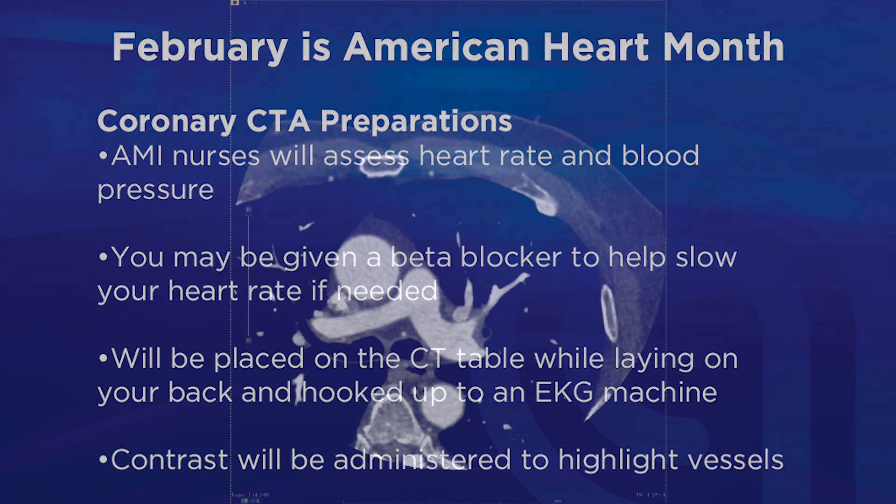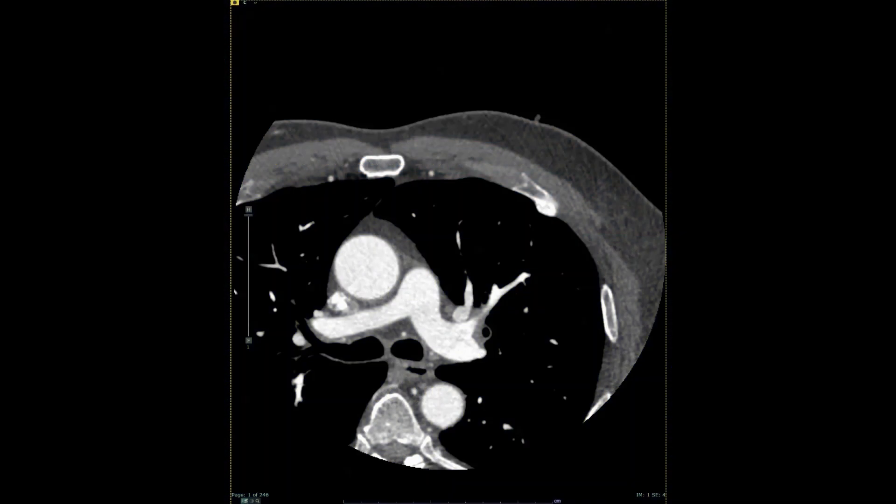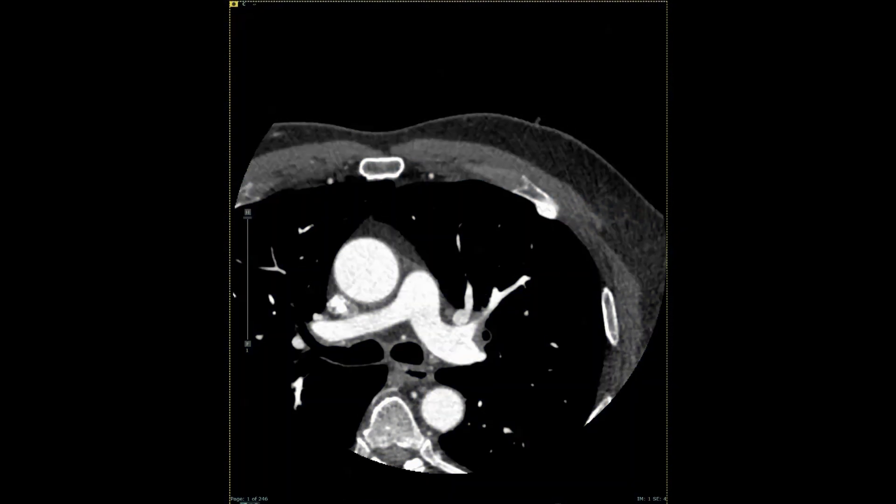The resulting pictures from the scan look like this. These detailed images allow the radiologist to interpret your heart and coronary arteries and to craft a report to relate to your cardiologist. I will now go over how I interpret these studies starting with the anatomy of the heart and vessels.